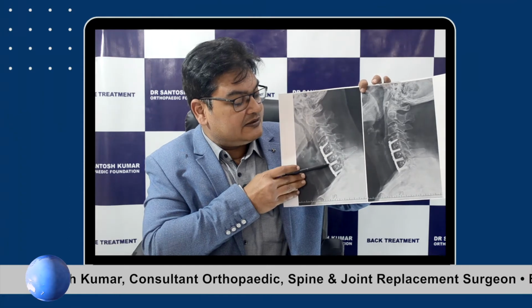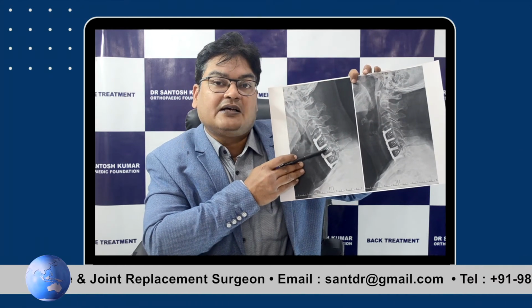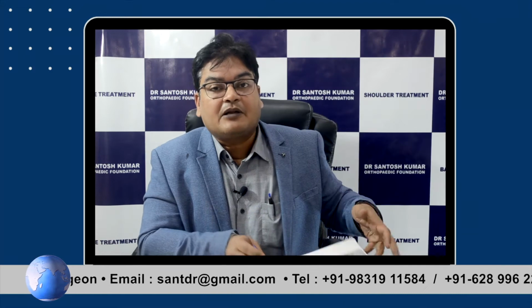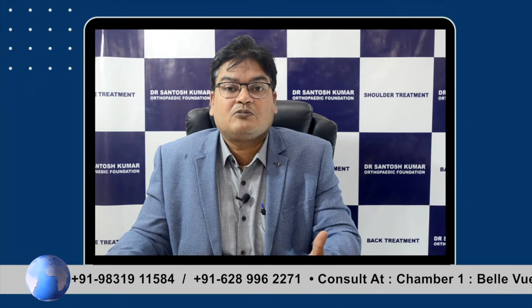There is anteriorly this. In this X-ray, we have done a fusion. The fusion is being shown at 3 levels. The disc has been removed, a spacer has been put and a plate has been applied. Now the problem with fusion is that it fuses that segment of the spine, but it doesn't mean that the person will not be able to move his or her neck.